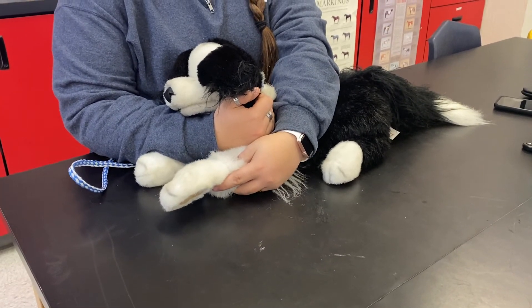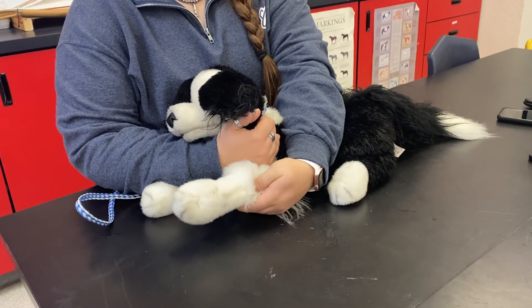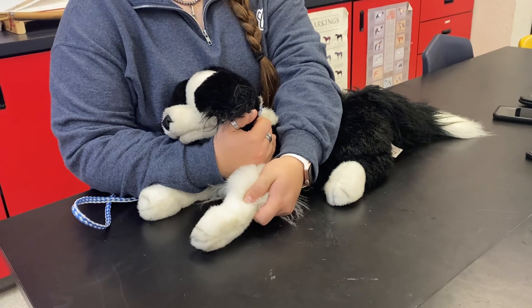With the elbow of the dog in his or her palm, the student rotates his or her thumb up so it is on top of the limb at the bend of the elbow. The student occludes the vessel with the thumb and rotates the thumb left.